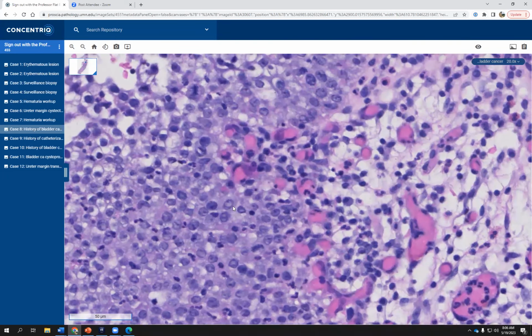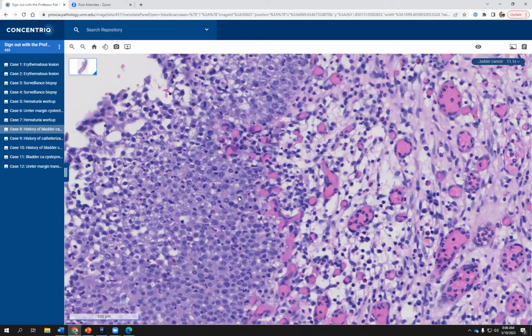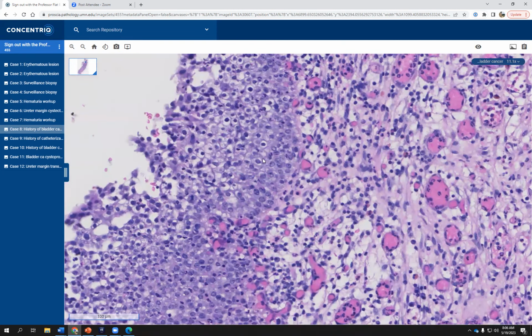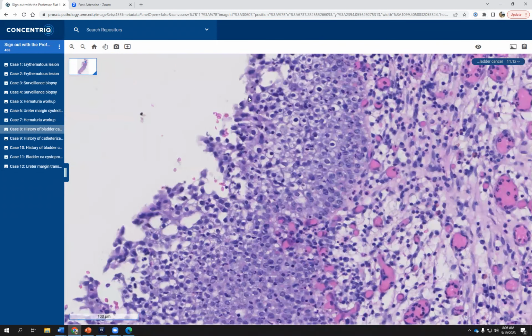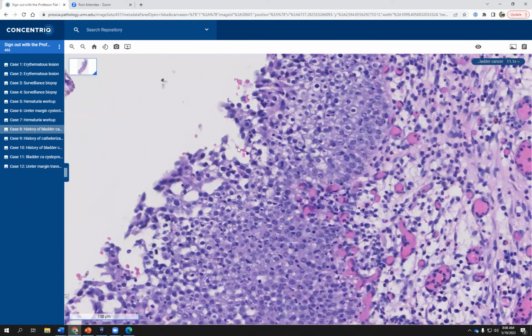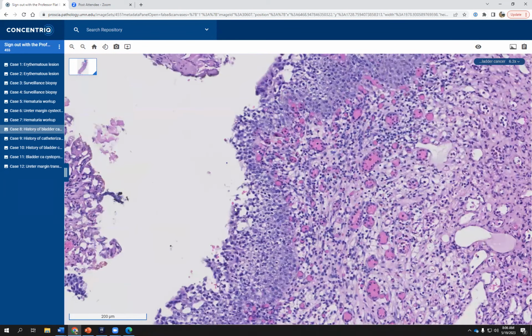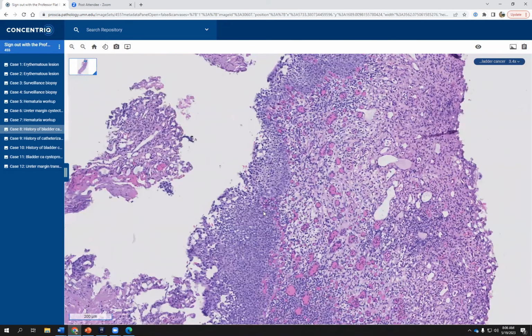And as you keep looking, you may also come across some mitotic figures. So here's possibly a mitotic figure right there. And then you can see another mitotic figure right here. So a combination of these features, including the fact that often you may have surface denudation and what looks like loss of umbrella cells, may make you think of atypia or carcinoma in situ.